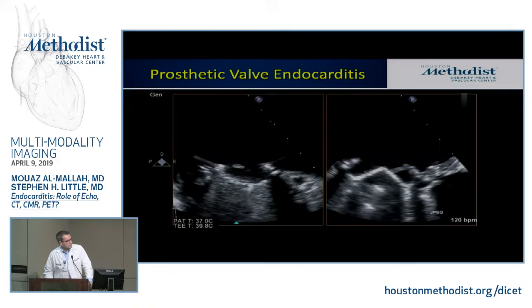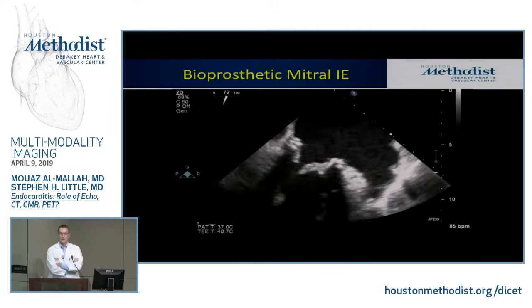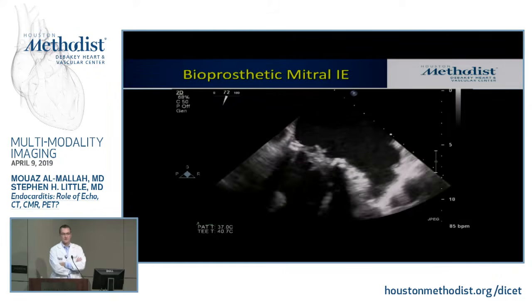This one is an interesting dilemma. So on a bioprosthetic valve, you do actually get vegetation on the leaflets because the leaflets are biologic material.